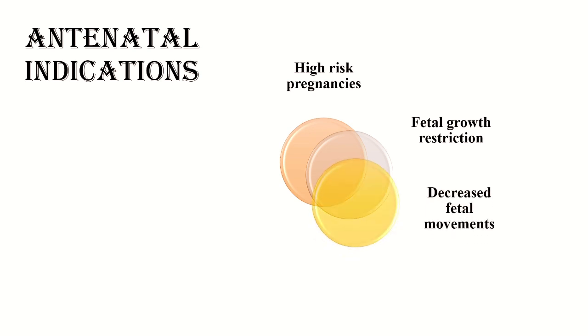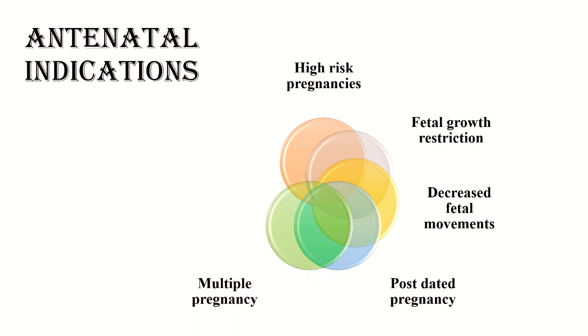decreased fetal movement. So, if the mother comes with the chief complaint of decreased perceived fetal movement, that is, if she is saying that she is unable to feel any fetal movement, or the number of fetal movements she is feeling right now is lesser as compared to before, then we can perform a CTG to assess the condition of the fetus.